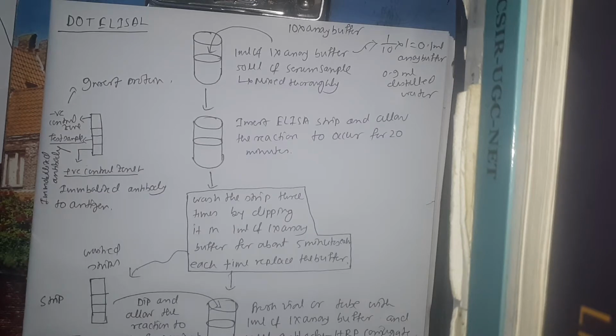In this video, we are going to talk about dot ELISA. You may be wondering why I have made a new video regarding dot ELISA. In our previous upload, I made a major mistake. I am sorry for that. I forgot to add the substrate, that is our TMB-H2O2, and I completed the video. So how this blue or gray spot formed, there was no clue about that.